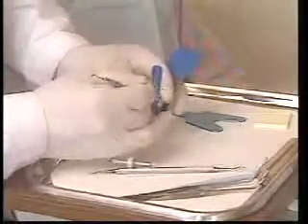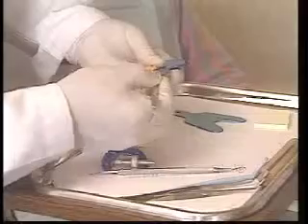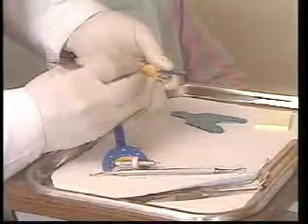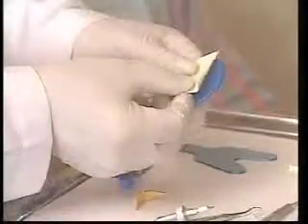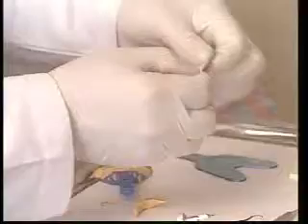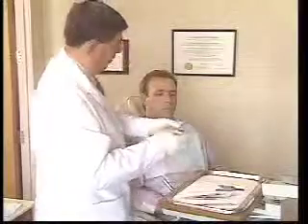Now carve away the excess putty from both clutches. To prepare for the bite registration, place a post-it note on the mandibular tracing area. The sticky end of the note should be away from the patient on the front edge. Bend the tips over the tracing area. Thread the stylus into the maxillary clutch with the drafting lead down. Place the clutches back in position.